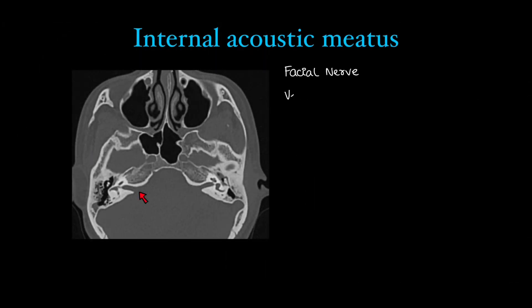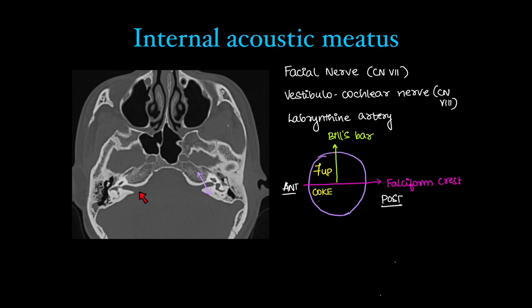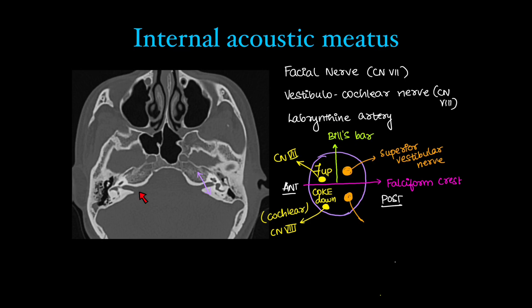The facial nerve (CN VII) and vestibulocochlear nerve (CN VIII) pass through the internal acoustic canal, along with the labyrinthine artery. The cross-section of the internal auditory canal is divided horizontally by the falciform crest, and the superior portion is divided into anterior and posterior by Bill's bar. The mnemonic is 'seven up and Coke down': the seventh (facial) nerve passes superiorly, the cochlear nerve passes inferiorly, and the vestibular nerve — with superior and inferior vestibular divisions — passes in the remaining compartments.